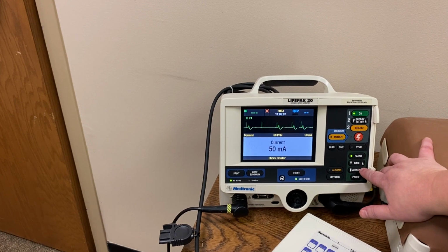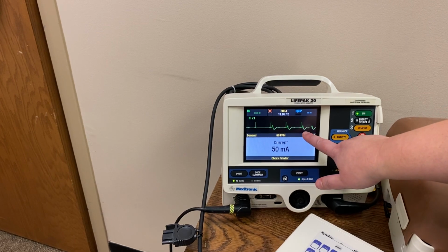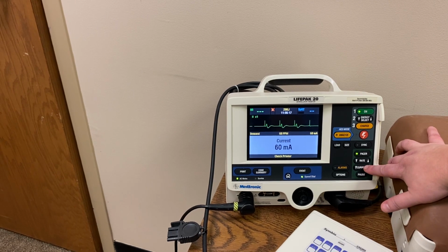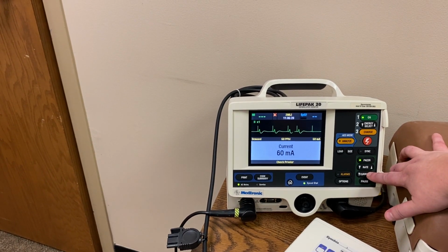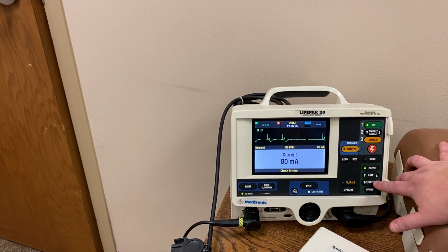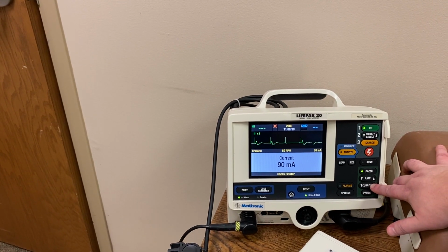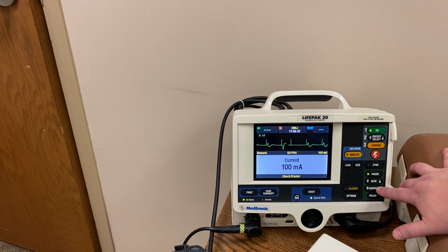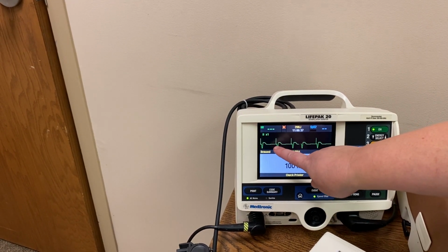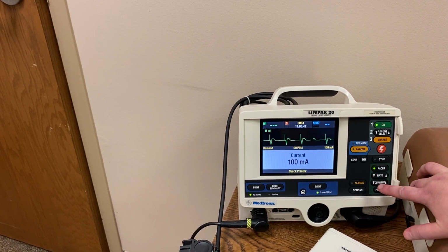So a capture is going to be a pacer spike with a wide QRS. As you can see here, I can see pacer spikes, but this is not capturing. Okay, so I'm going to keep going up on my current till I get a pacer spike with a wide QRS. So as you can see here, it changed. So I have a pacer spike, wide QRS, pacer spike, wide QRS. This means that we have started capturing our patient.